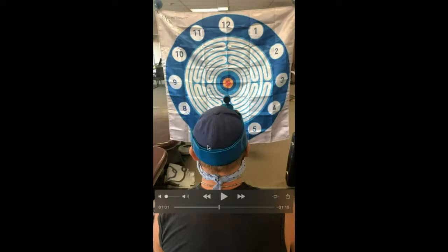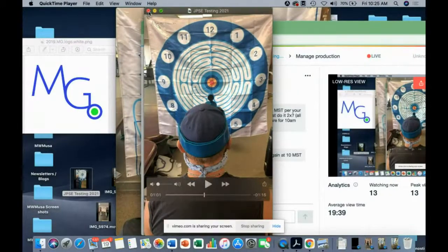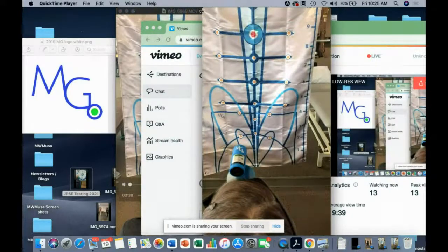If you're getting more dynamic, which is what I do with my concussion patients later on after they're feeling good, I'll come back and do their quadrant, which is not very research-based, but it kind of follows the same idea of, hey, can I have you look up and to the right and come back down to where you think it is? Can I have you look up and to the left, down and to the left, down and to the right, and make sure that everything is kind of normalized across there. So I'll adapt the standardized testing into more dynamic applications with that. All right, so that's joint position sense error testing.